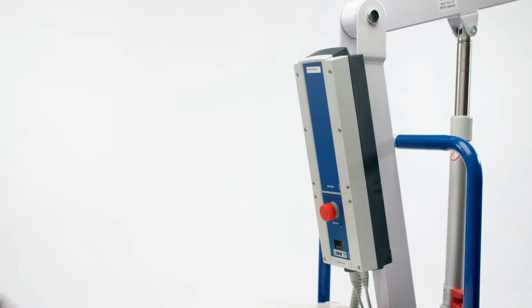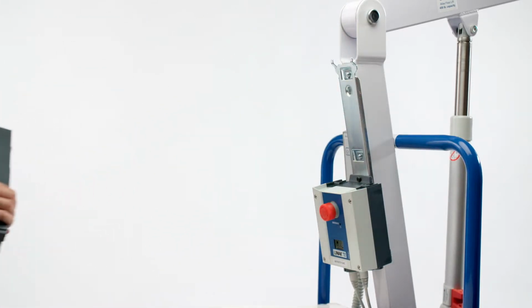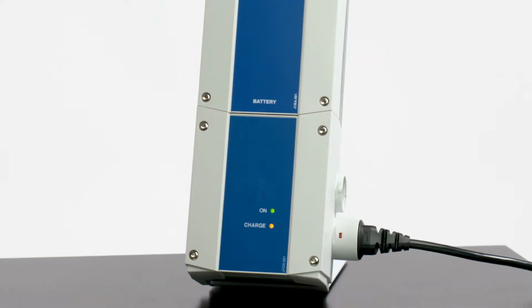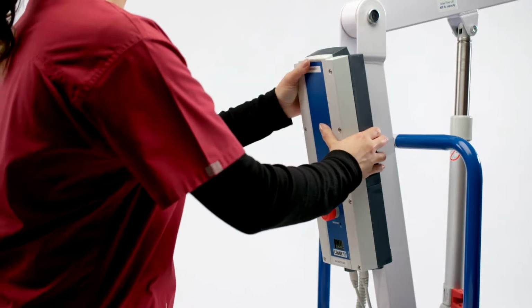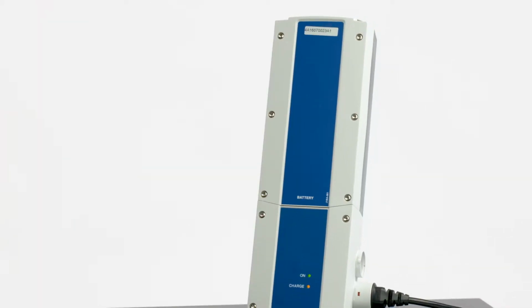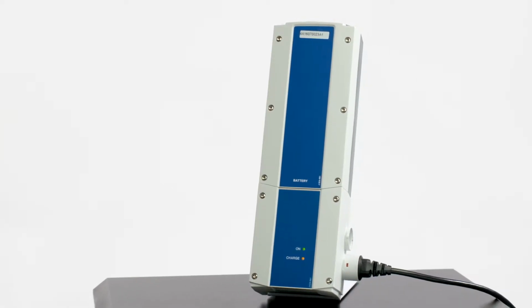To charge the battery, lift the handle on the back of the battery and then lift the battery up and away from the control box. Place the battery on the charger and listen for an audible click. Once fully charged, reinstall the battery onto the control box and listen for an audible click. As a best practice, we suggest you leave one battery on the charger at all times and rotate the batteries on a regular basis to coincide with routine activities, such as shift changes.